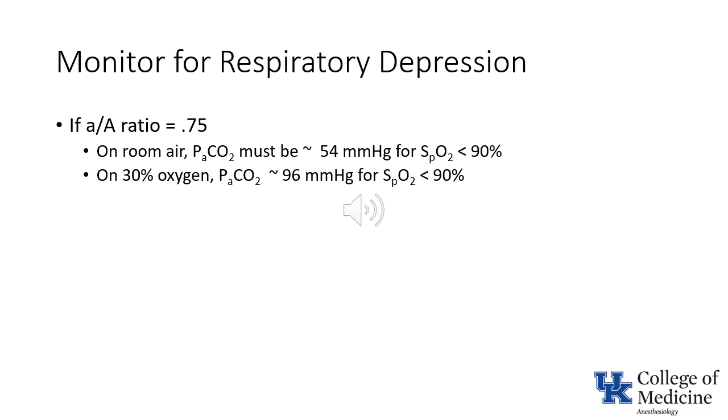Again, when administering oxygen by nasal cannula, when was the last time you used a flow rate of less than 3 liters per minute? Remember, if you want more details on these calculations, review the appendix, which appears after the photograph, which normally indicates the end of my presentations.